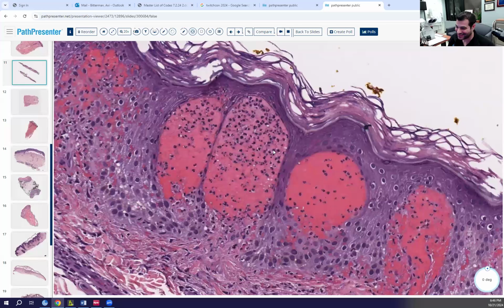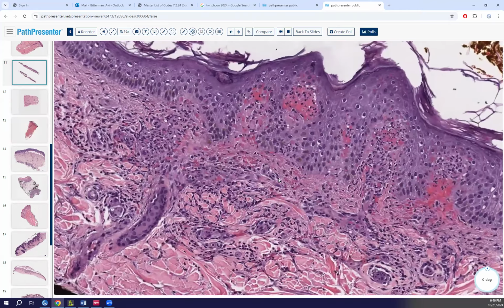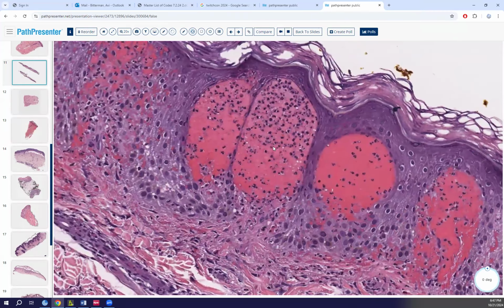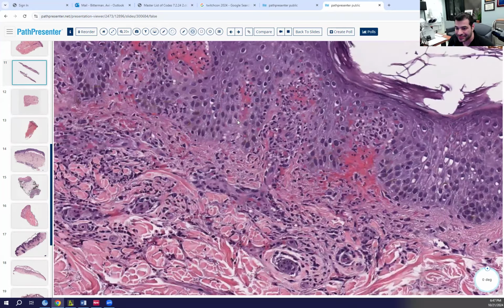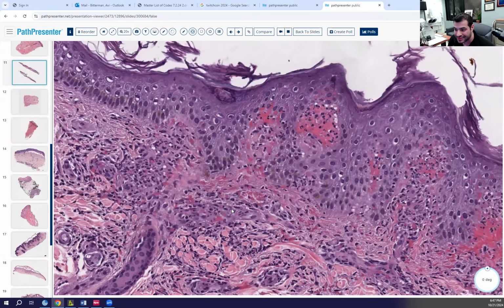Look, what cell? Neutrophils. Oh, so it must be DH, right? No. I mean, that's really eosinophilic, whereas in DH it was more hypochromatic. Are they EOs though? No, I mean that eosinophilic material. What do we think all this eosinophilic material might be? Like fibrin, maybe. Some of it is the collagen, but there are some other cells in here too.